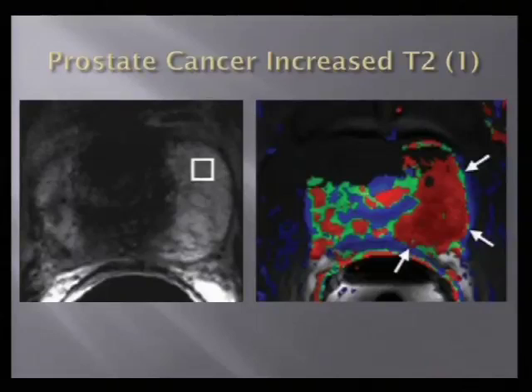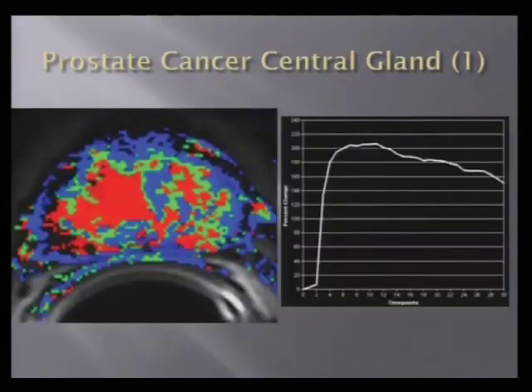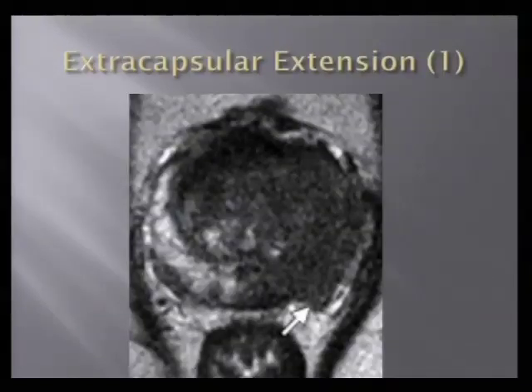And for all we know, this goes into the debate of the usefulness of prostate imaging. For all we know, there was a biopsy-proven 4+4 there anyway. I don't know, but I'm just trying to exemplify for you. The reason you do multiparametric imaging is because it won't always fit all of those criteria. And here's just an example of a dark central gland that's prostate cancer from the literature. And again, this is that same case showing the rapid washout, and it shows the effectiveness of the color map to try to identify things that won't necessarily show up with T2.